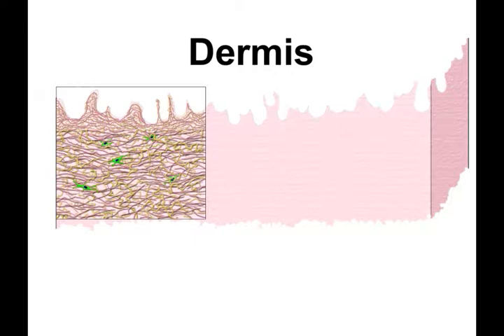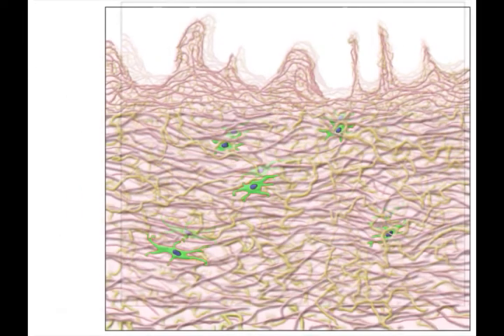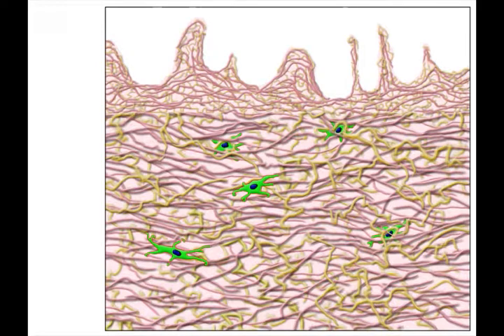Antigen-presenting dendritic cells, both a factor 13A positive population and a CD34 population, are noted within the dermis. At higher power, we see the papillary dermal collagen as much looser, and then below that the coarser reticular dermal collagen, and embedded within that the dendritic cells.